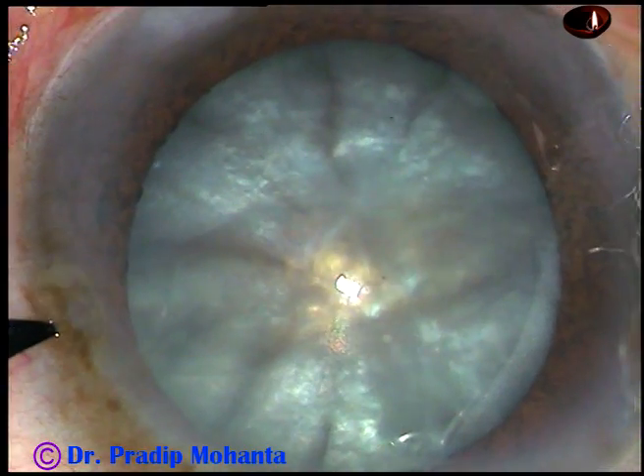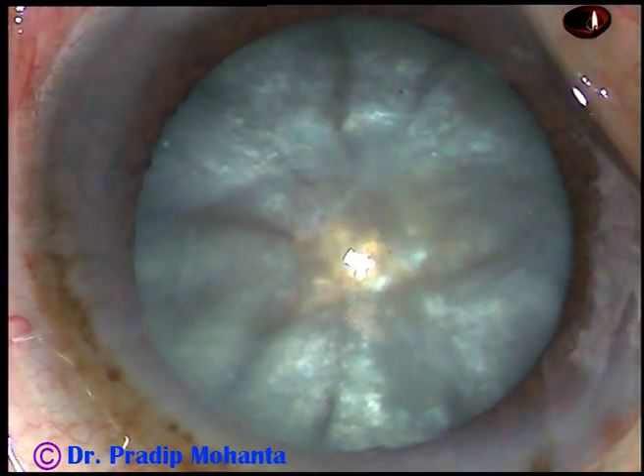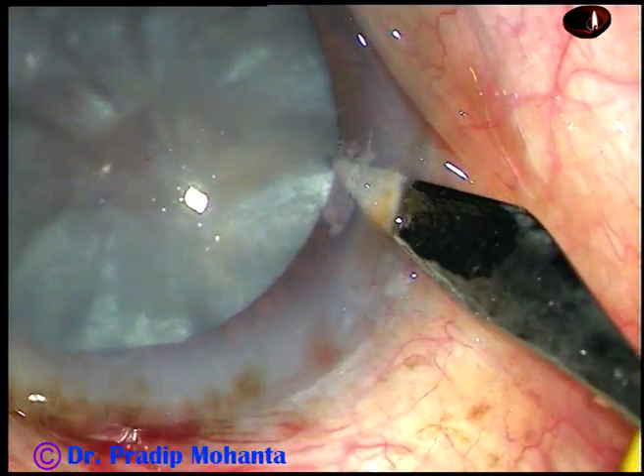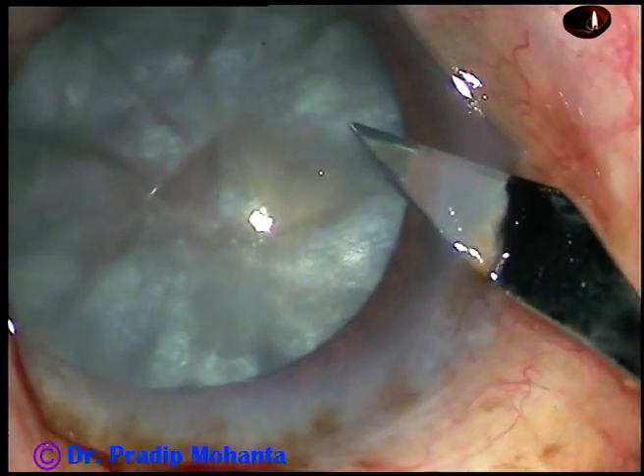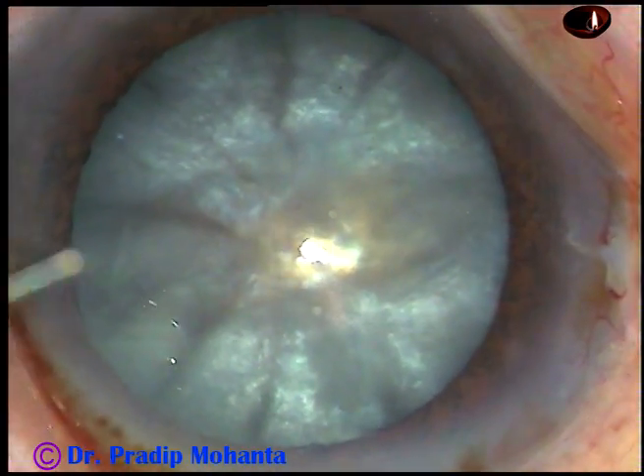By this time, the main incision has been made. And this is a side port on the left side of the main incision. And this is another side port on the right side of the incision. The patient is under peribulbar anesthesia.